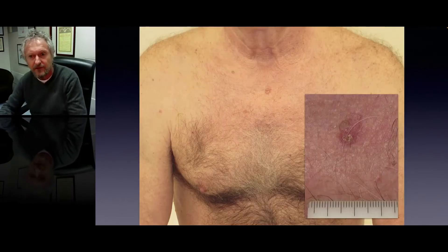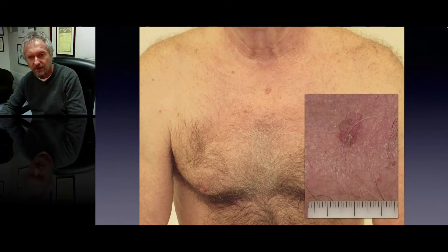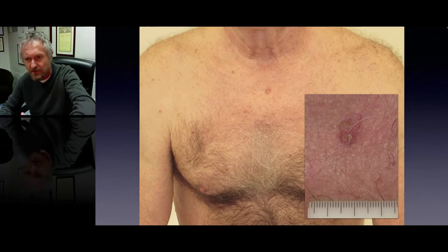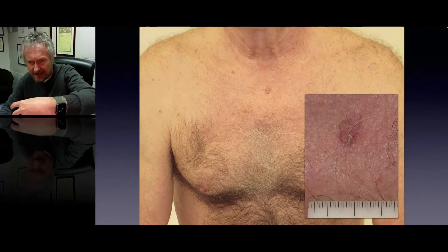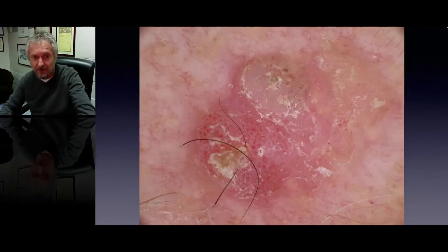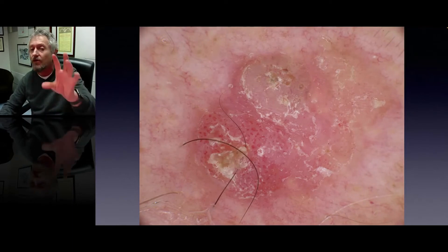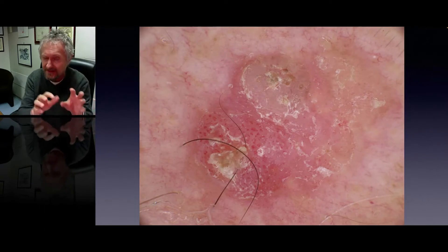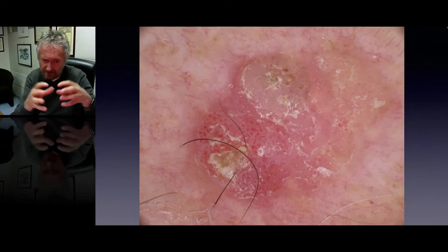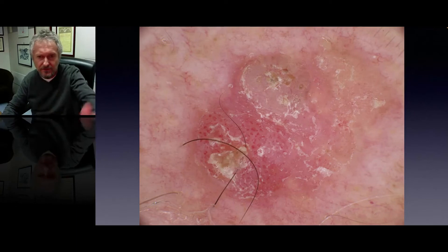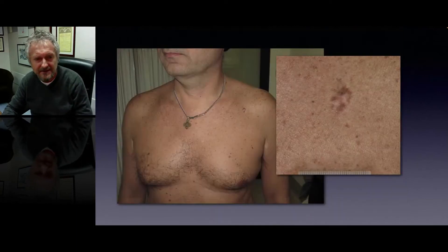This is a newly discovered dermoscopic criterion. Here is a good example of a non-pigmented Bowen's disease where you can see clinically a scaling plaque, and dermoscopically, look how beautiful these glomerular vessels are — usually packed closely together in clusters within the lesion, with additional scale crusts.